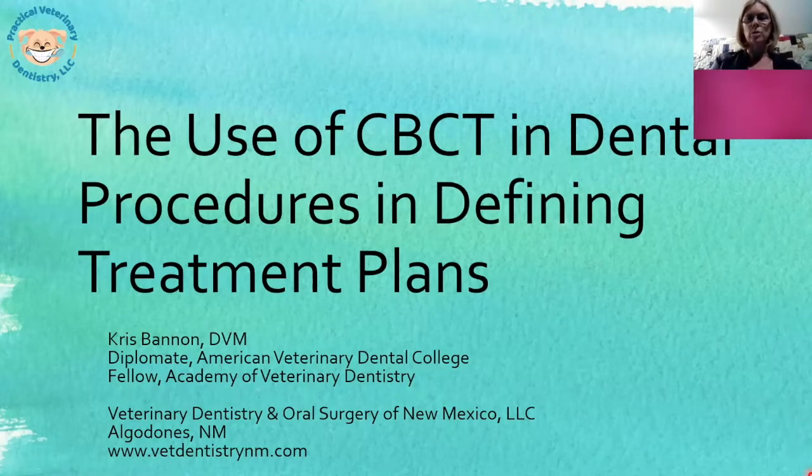I'm going to be talking about using the cone beam CT in relatively routine dental procedures and how it has changed my practice and how it has changed the way that I'm treating my patients.